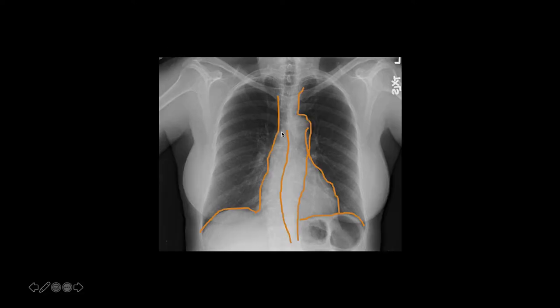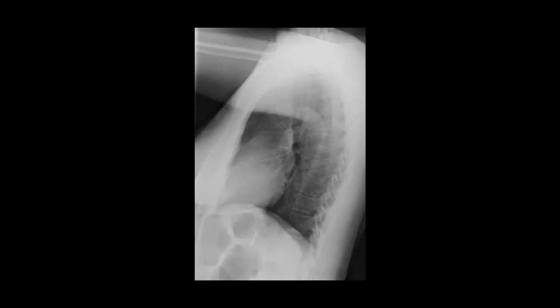Here are additional lines: the azygos-esophageal recess, which you can see in most X-rays, and the AP window. You want to make sure that you can trace all these lines on every X-ray. If a line disappears at some point, that means there's either a mass there or it's being silhouetted by, for example, a pleural effusion or airspace disease.